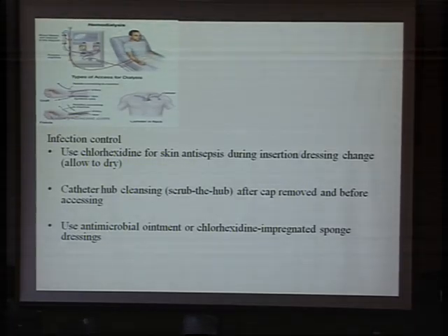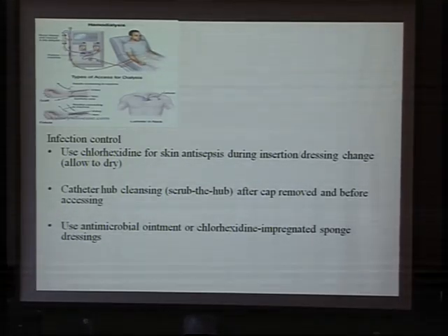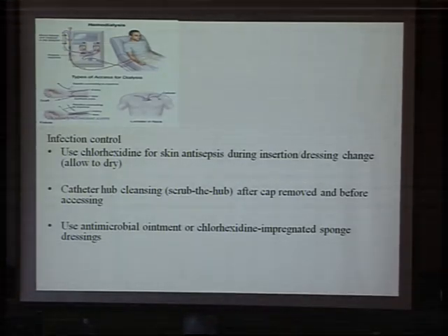Another publication said that's okay, we can clean with chlorhexidine 2% or alcohol or povidone iodine. All are okay, but do you think that some disinfectant can go to the blood through the catheter? A little bit, and there's no obligation about that. So when you have the hub, you can clean by swab a little bit and let it dry and then start the procedure.